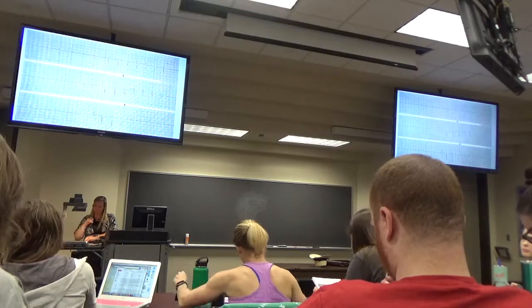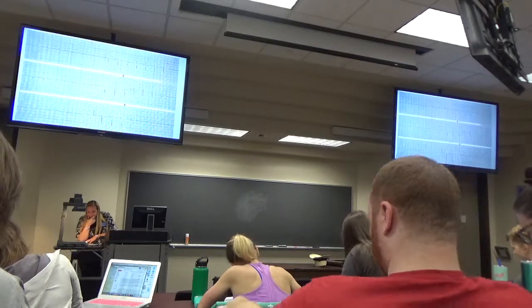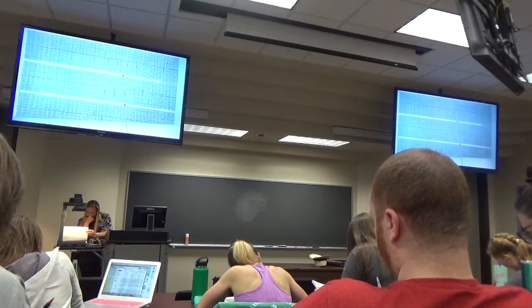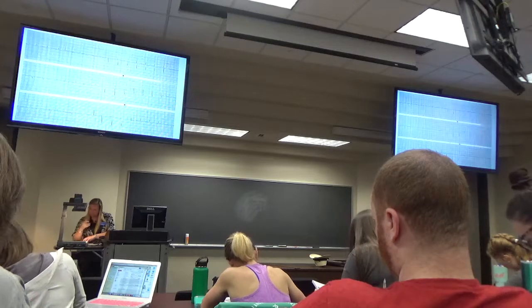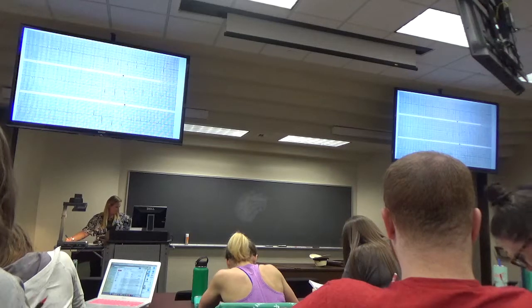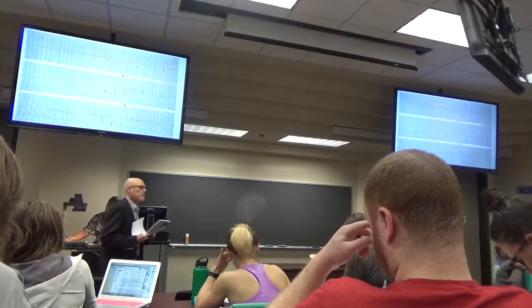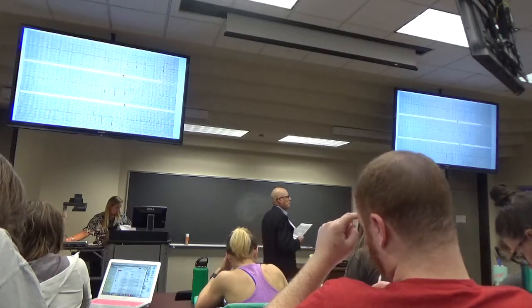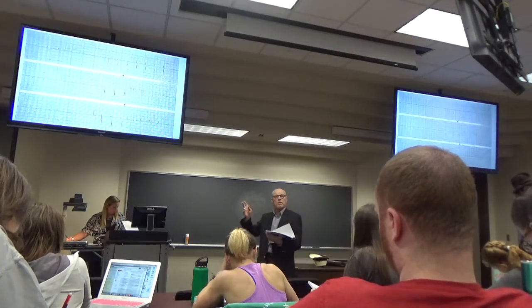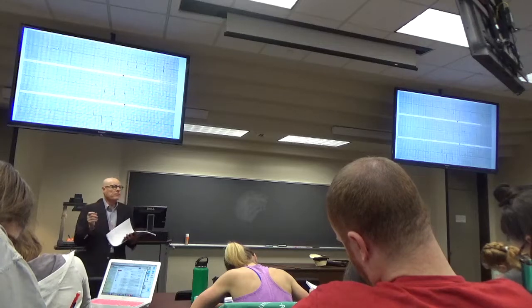Did anyone find a short PR interval in this one? I thought the PR interval in AVF was too short. It's a little short in lead 2 as well. I think this is probably a pre-excitation syndrome because the PR interval's too short. The problem with that is if it is a pre-excitation syndrome, then we can't necessarily call the inferior infarction. Right? There are 2 exceptions to the infarct Q-wave rule. One's a pre-excitation syndrome and one's a left bundle branch block. So it's hard to call this an inferior infarction if the PR is too short.